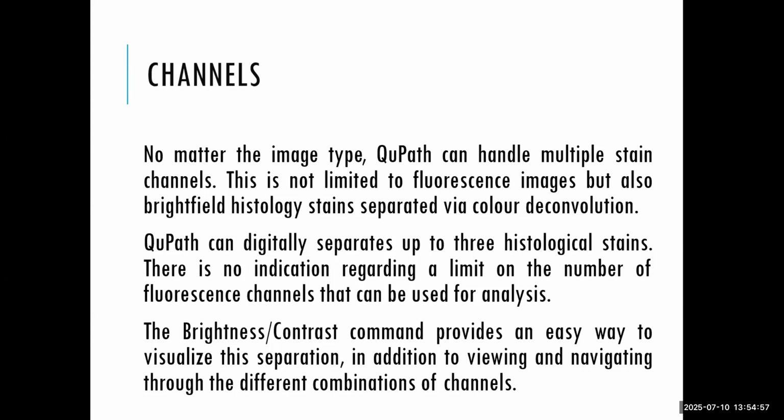Now, what we can do is what's called a color deconvolution, which allows us to separate those stains out computationally, and it's pretty accurate because they are very well-known stains, DAB and H&E. We've used them for many years. So those stains, what's called the stain vectors, are well known. We'll go over stain vectors in a minute.